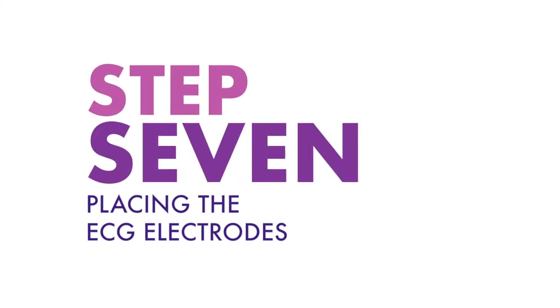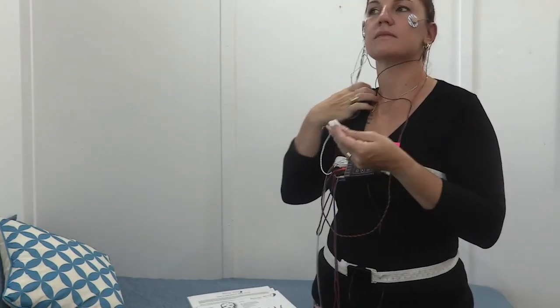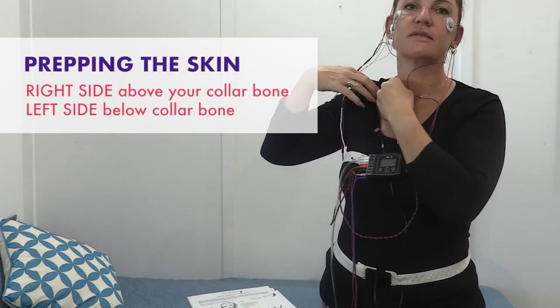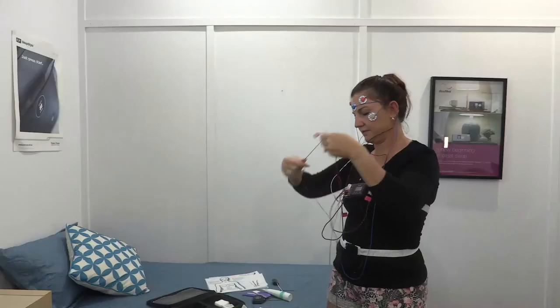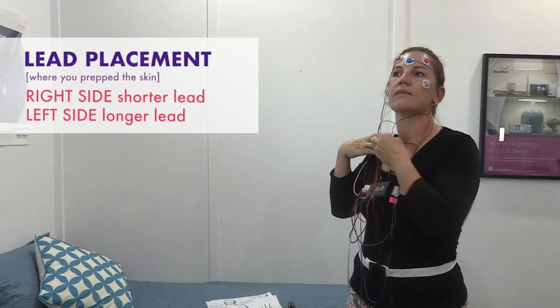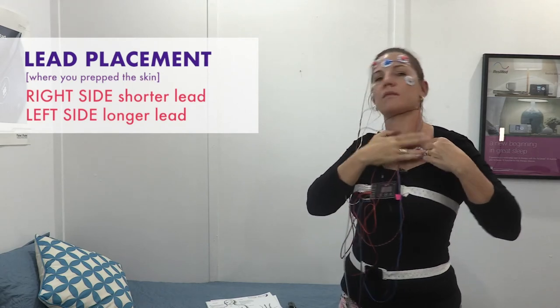Step seven: placing the ECG electrodes. These sensors will show us what is happening to your heart rhythms during sleep. You will need to prep your skin for the ECG lead placement just like you did to your face. On the right side, prep your skin above your collarbone and on the left side, just below the collarbone. Find the shorter orange twin cable and stick an electrode to each lead. Place the shorter one to the right side where you prepped your skin above the collarbone and the longer one to your left side below the collarbone.